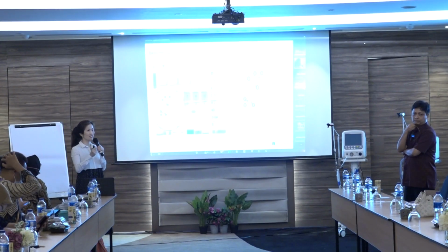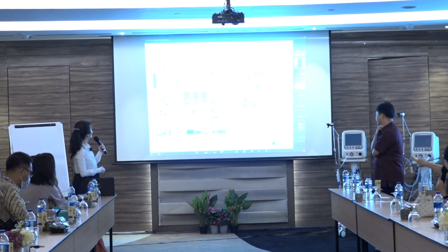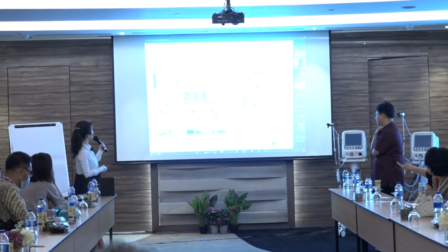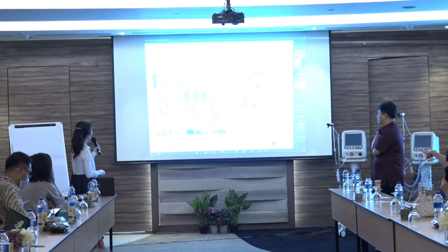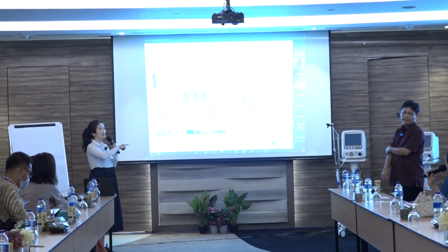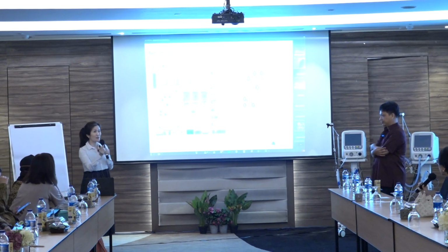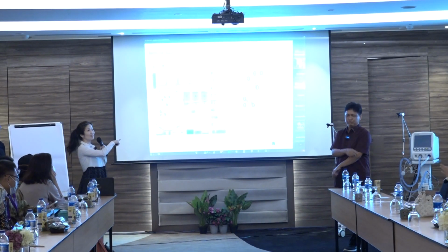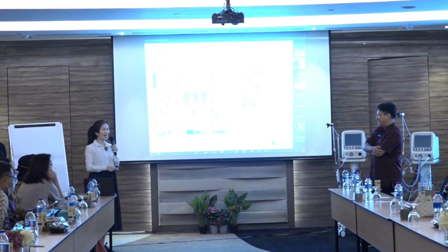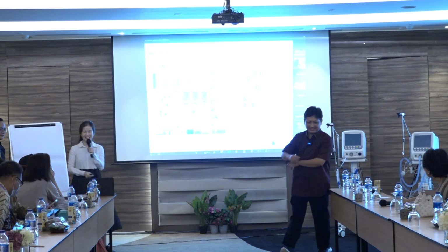So in this patient, the optimal PEEP is around 10. Right, 10. So how can we set it? We will need to go back to the ventilator settings, and then we will change it. This one maybe during the hands-on we will show you how it looks, and then from there we can do the settings change. I will not be in your hands-on because I have to teach another session with volume guarantee during the workshop. But during lunchtime or after this, I can show you very fast.